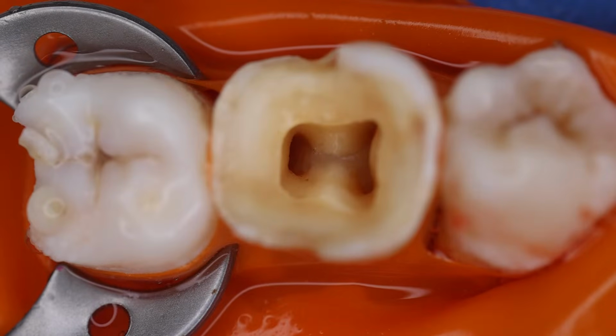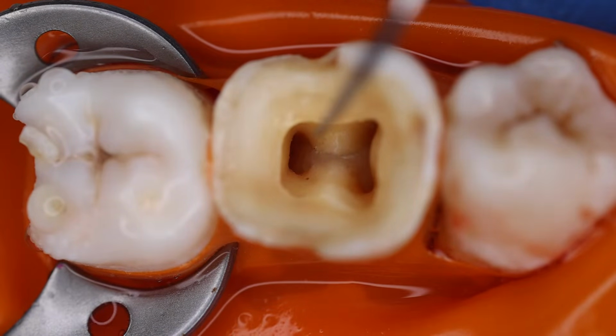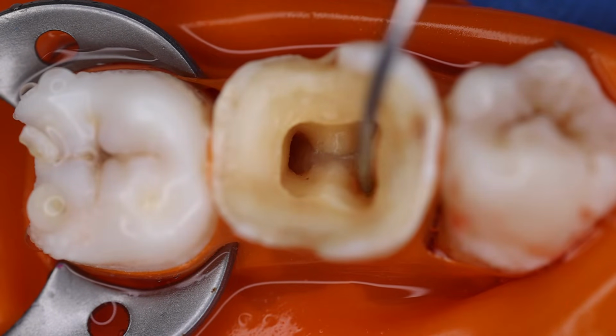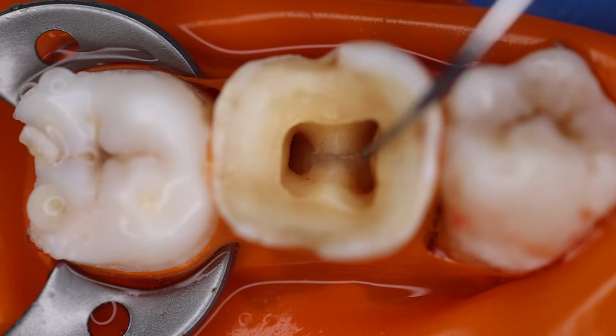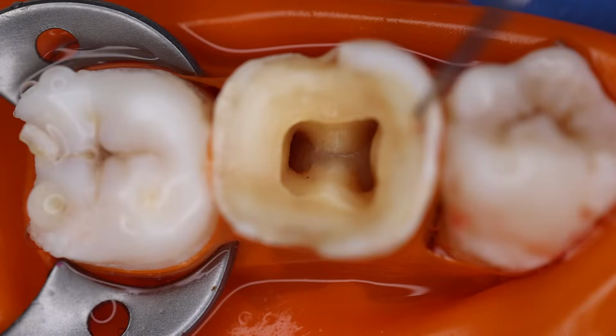Now you can visually see that we could maintain the healthy tooth structure and identify the canal orifices. This is the distal canal orifice over here, a large one. Then there is the mesial canal orifice: this is the mesiobuccal canal orifice, and this is the mesiolingual canal orifice. And this is the dentinal map that we can see. So this is how we are maintaining the healthy tooth structure.